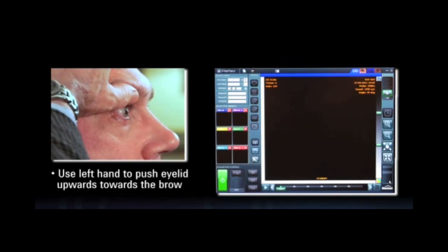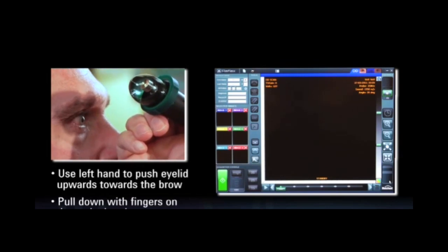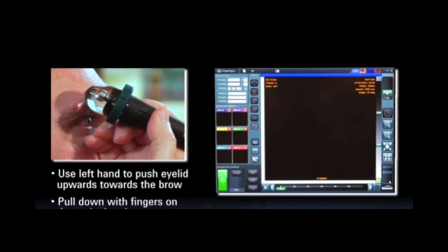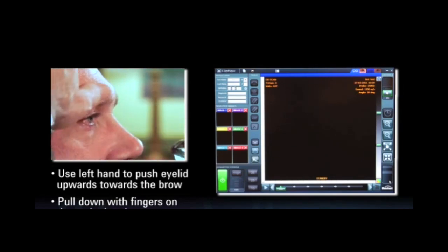I do what's called the faux speculum technique. I want the fissures to be open, but I do not want to increase pressures within the eye. I'm going to take my left hand, push it up to the bony brow, and look at my fingers. They're curved here, sort of like a tower of fingers. I'm going to pull down with these fingers with the same hand that I have my probe.